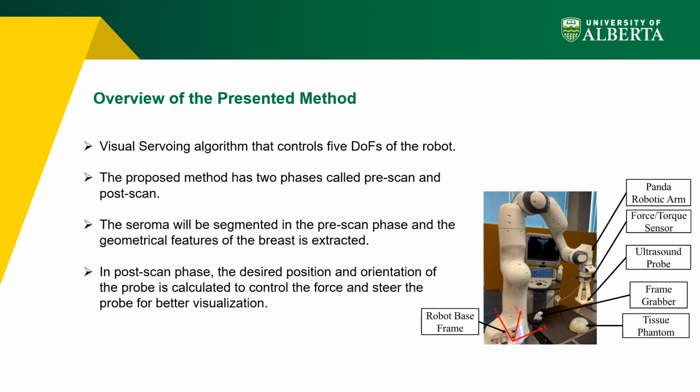The setup is shown in this figure. We use Panda robotic arm for moving the probe on the surface of the breast, and the image is being sent to the host computer in real time with the frame grabber.